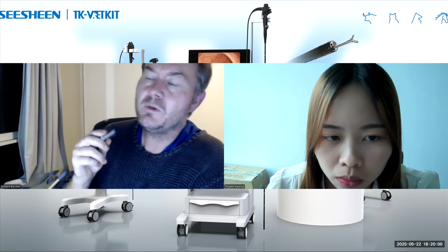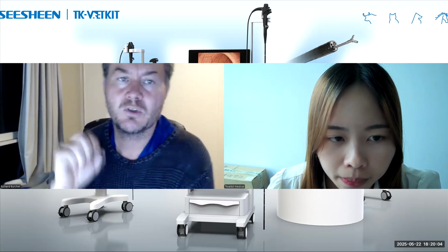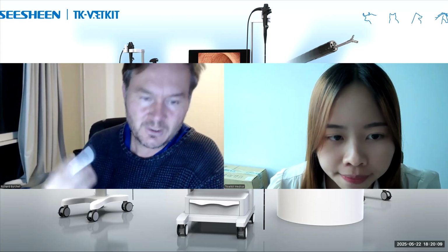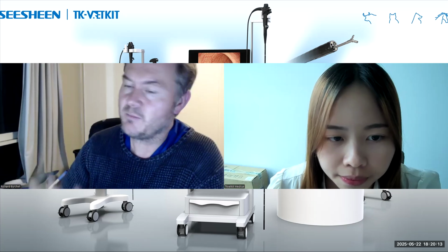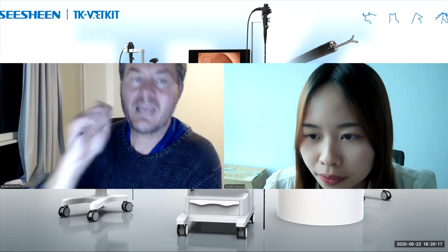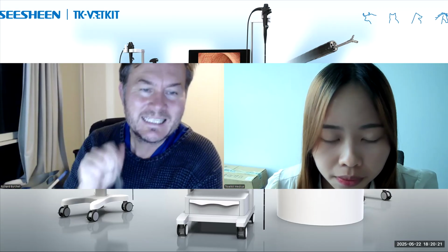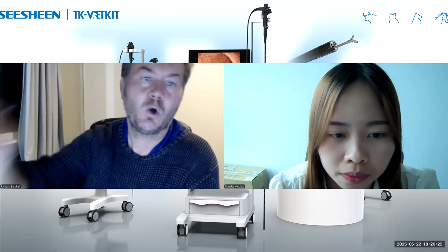What I'd say is if you're learning and you don't want to be under pressure where you feel like you need to do it quickly, then scope the lower airways, have a good look at them, do a thorough job through the ET tube. But then when you extubate, have a look at the airway that was underneath the ET tube so that you've at least had a look at the whole airway.